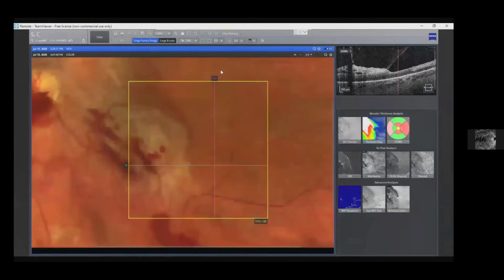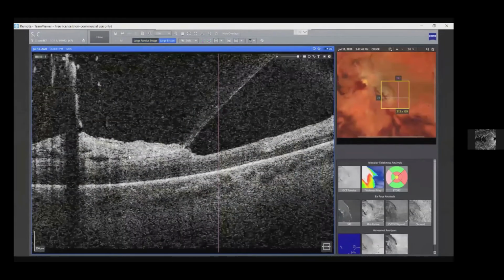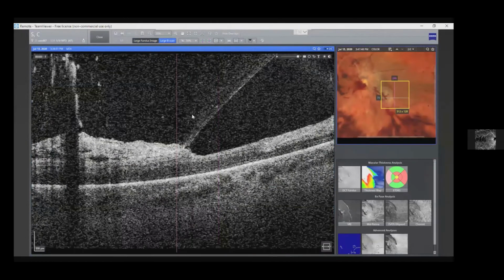So here is our same photograph, and now we have our B-scan OCT data here. We can correlate, and so we can actually look and see, for instance, just temporal to this fibrovascular complex, the hyaloid's elevated, right? Obviously, one of the important steps in treating diabetic tractional retinal detachments is you have to release anterior-posterior attachments to find areas where the hyaloid's elevated and pierce or transect those and relieve attachments around the fibrovascular complex for 360 degrees. That'll help prevent peripheral breaks.